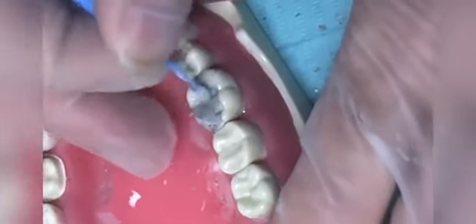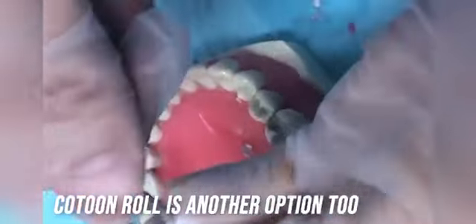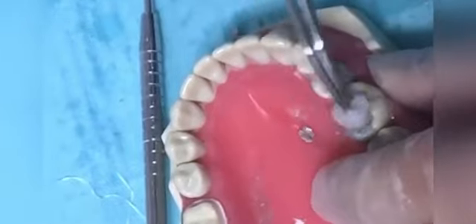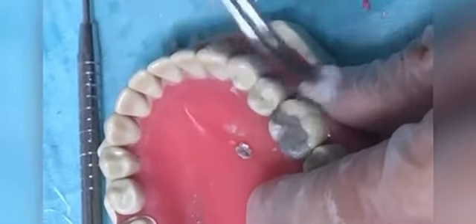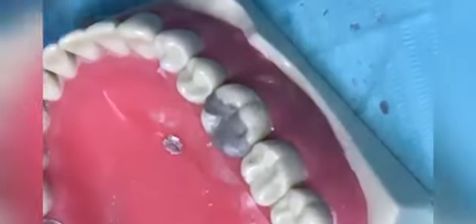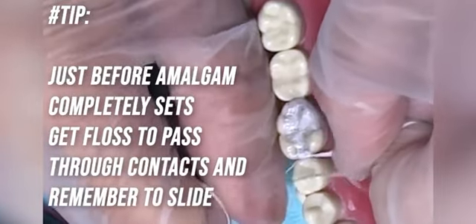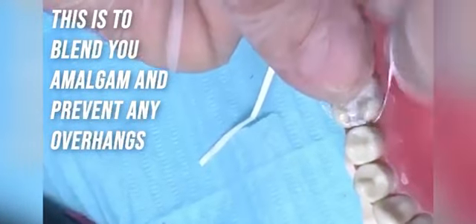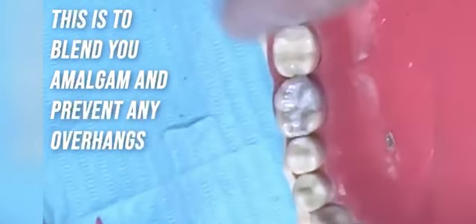So in the end, double check all the criteria, whether your marginal ridge height is equal to the adjacent teeth or not, whether the cusp height is okay or not. One of the criteria is maintaining the cusp contour. So you need to get the two slopes while you are making the cusp. Okay, and there should not be any ditches. If there is any ditch, just take the amalgam which is not set, add some little extra, and you can just condense on that part only.